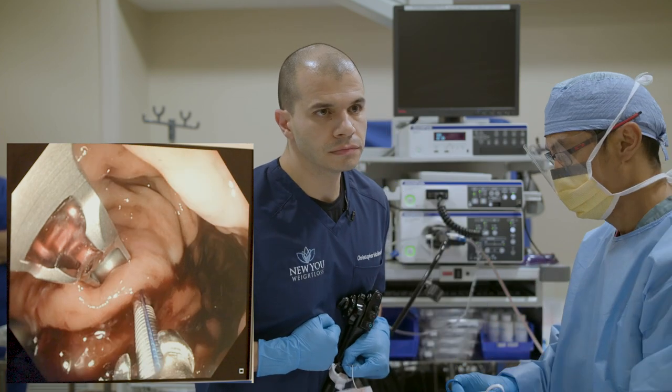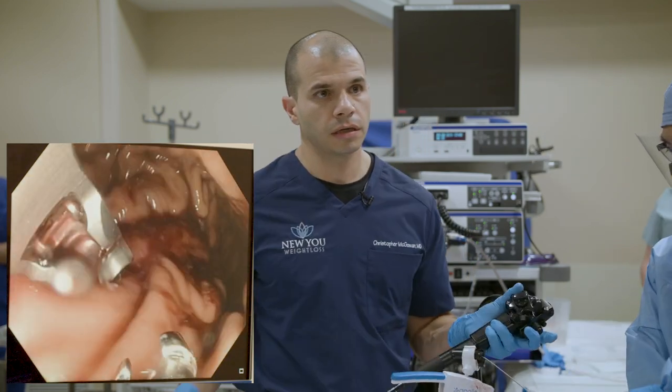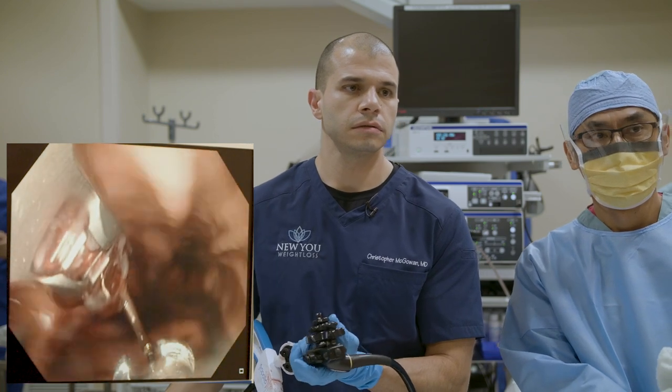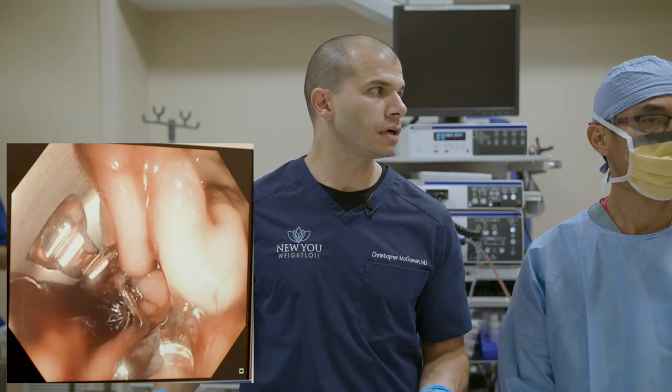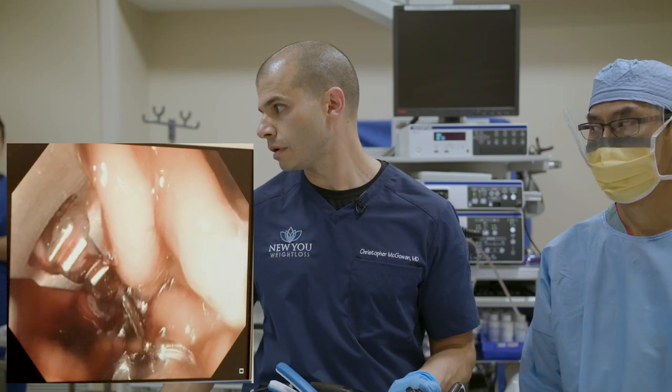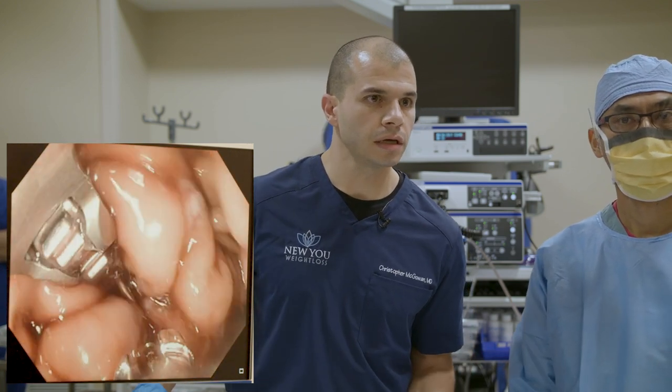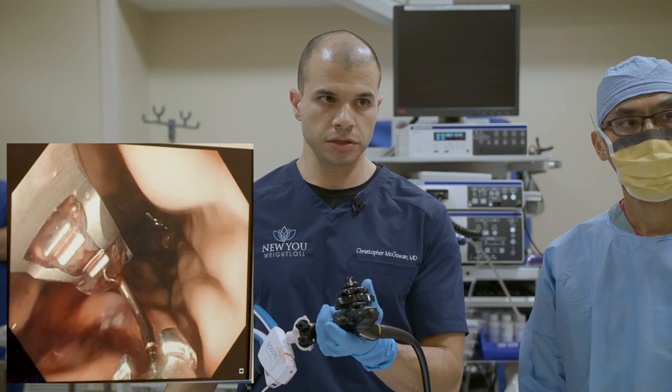We're pulling this in and cinching the last one. I'm going to clean up a little bit and have a look — I think we're probably done, it's looking really tight. That's about 50 minutes total. When we're finished, we're going to wake our patient up. She'll be up within a couple of minutes in recovery. We give a tiny bit of Fentanyl, which is a short-acting pain medicine, and Toradol, which is an anti-inflammatory. We give three liters of total IV fluid during their entire time here, minimizing risk of dehydration over the next couple of days.